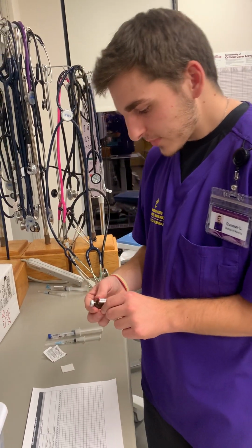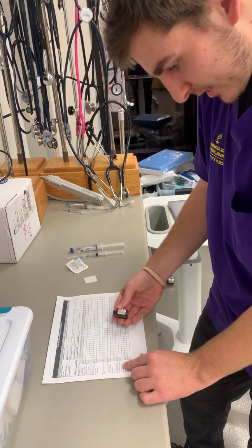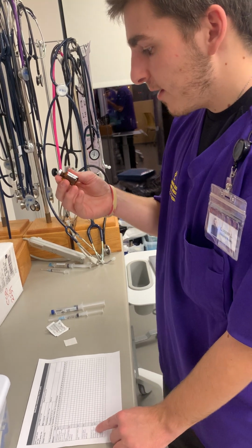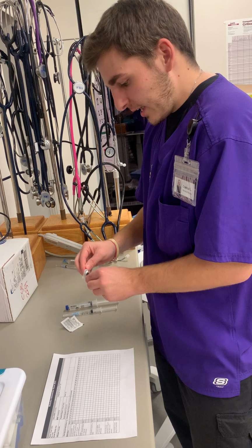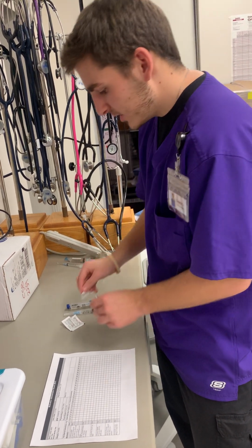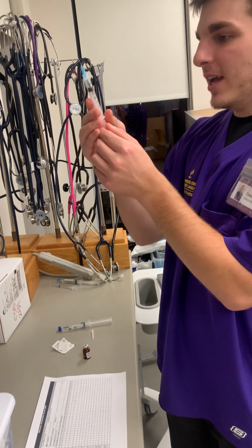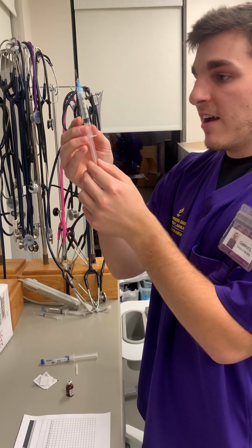us today. So now I'm looking on the MAR, and seeing that we need dexamethasone 10 milligrams IV, and here we have 20 milligrams per 5 milliliters, so we are just going to get 2.5 milliliters. So I'm going to scrub for 15 to 30 seconds, as well as at this. Then I would draw up the air, and I'm going to get 2.5 milliliters of air.